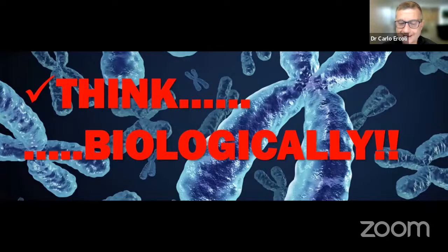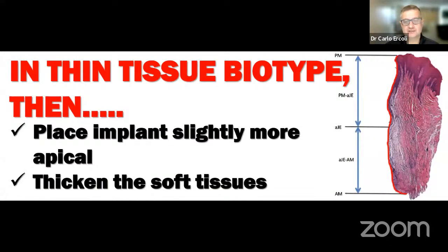So we need to think biologically. We can't just think mechanically. And when I say think biologically, it is that you need to anticipate, again, the formation of the biologic width. So if you only have 2 millimeters available, either you thicken the soft tissue, you make it thicker to about 4 millimeters with some form of grafting, or you may need to place that implant slightly subcrestal in order to anticipate, again, that crestal bone loss that will, and I say will surely occur as the biologic width forms.